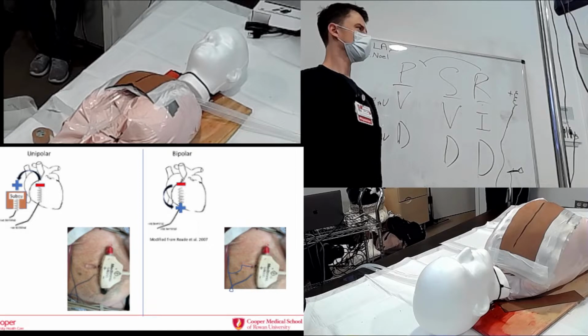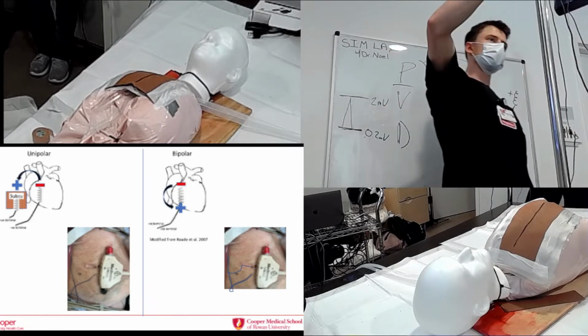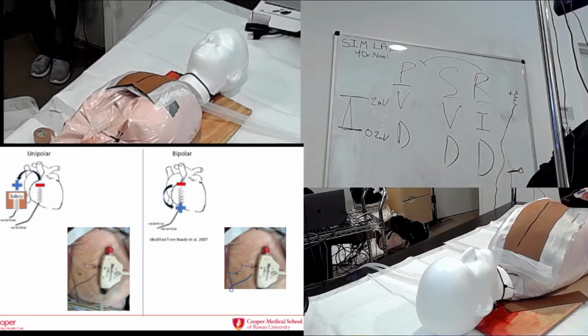You can check to make sure the leads are in place, just troubleshoot. Okay, so you're troubleshooting, right? You're running your circuit. It's plugged in, it's on. You're running here. These connections are in. Right. Okay. Good. All right, they're all in.